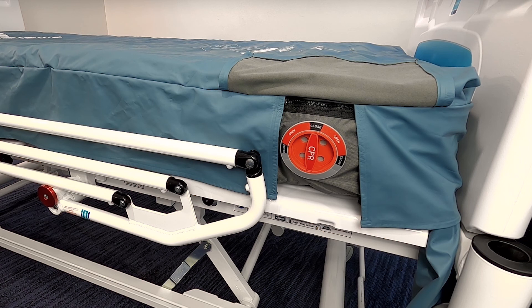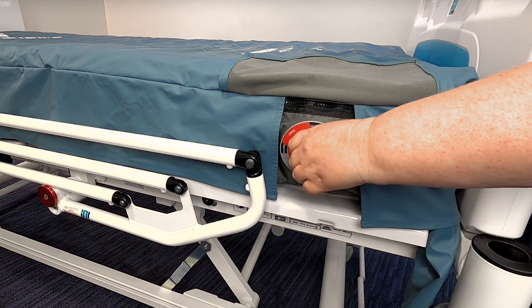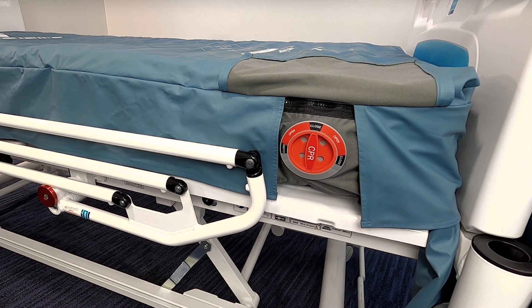Rapid deflation of the mattress may be required for an emergency situation or for system deflation. In an emergency or to deflate rapidly, turn the CPR dial to the open position. Turn the CPR dial back to closed to reinflate the mattress. Wait for the mattress system to reach its optimal pressure prior to return to normal use. Once reinflated, ensure the correct settings are reselected for the patient.